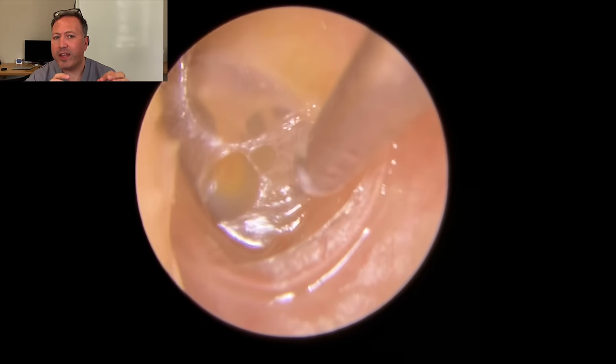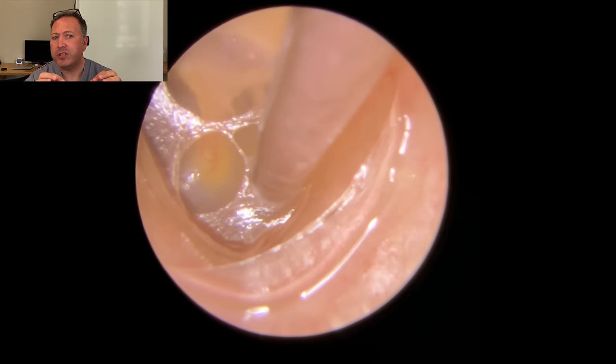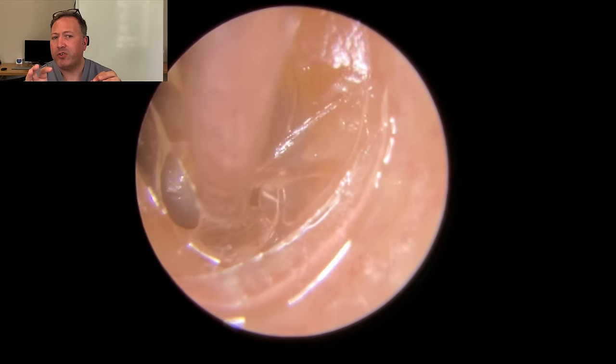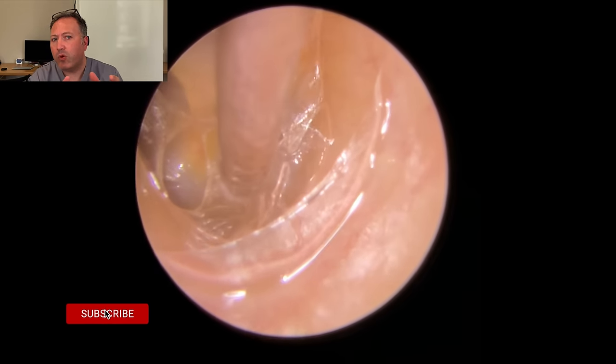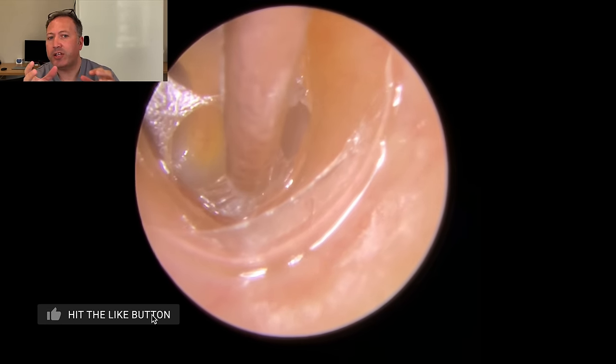So we're going to use the fine end here. There's a little bit of olive oil the patient's introduced in here as well, which is adding to that sheen effect. But when you get a grip on, look, see how this starts to peel away from the canal wall? There, see it lift from that right side. I'm trying to get a good enough grip.